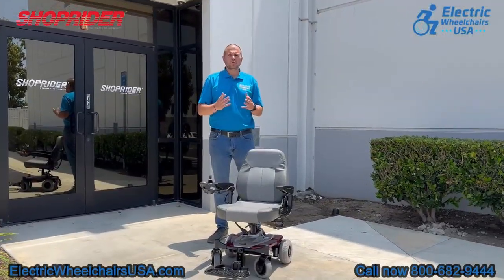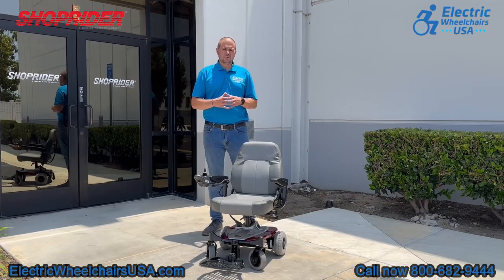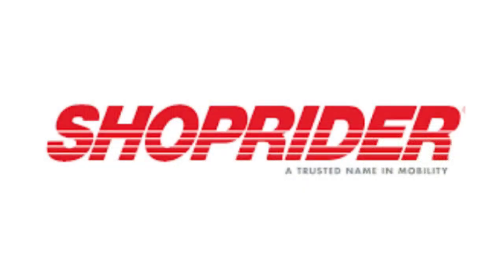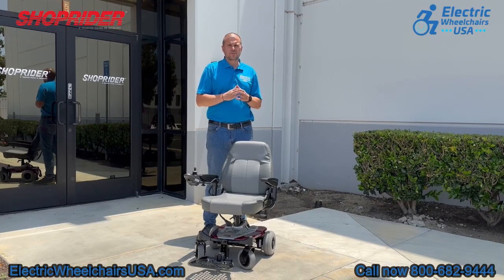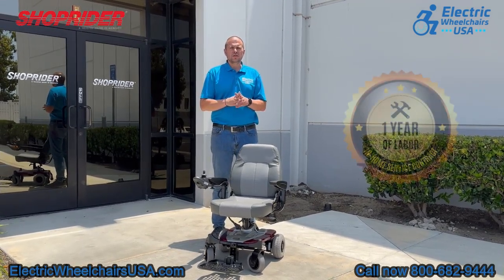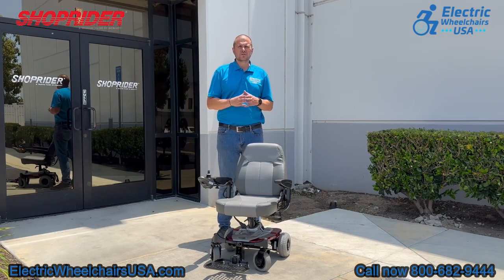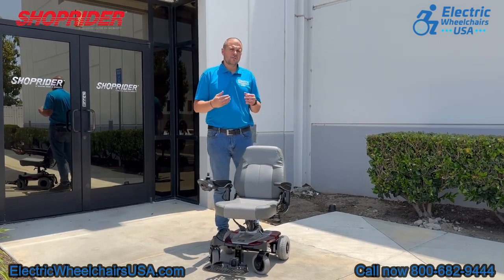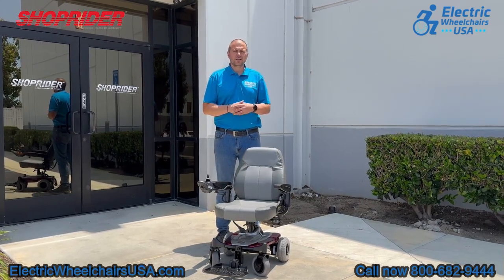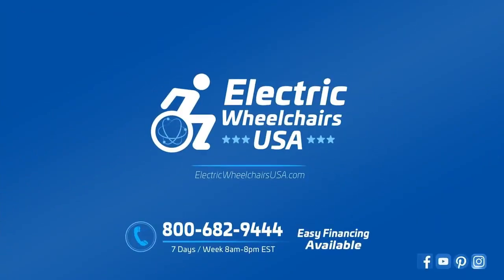If you're looking for a great portable power wheelchair that's easy to break apart, travel with, and reassemble, the Smarty is an excellent choice. It's made by ShopRider, one of the most trusted brands in the powered mobility industry — in business for over 30 years. They also have one of the best warranties, including one year of in-home service, where a technician will come to your home to diagnose and resolve any warranty-approved issue. For questions about the Smarty or any ShopRider products, call 1-800-682-9444 or visit electricwheelchairsusa.com.